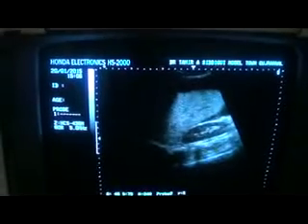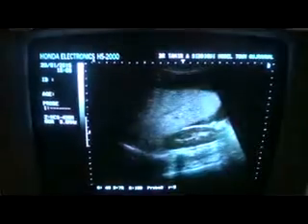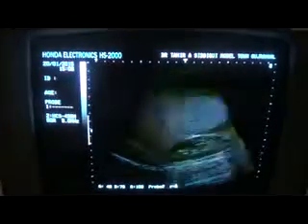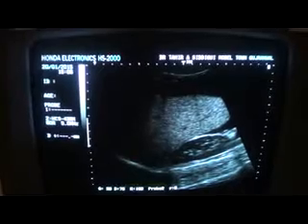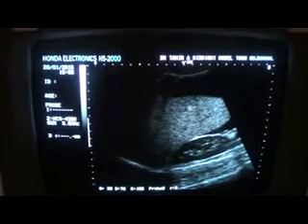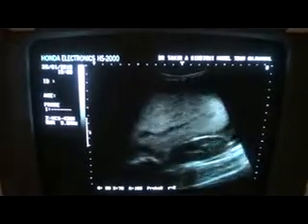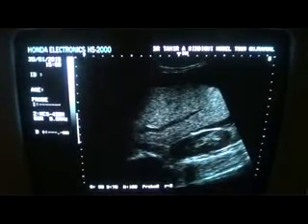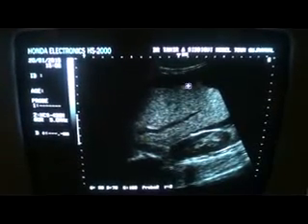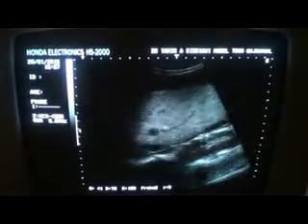This is an ultrasound study of a 35-year-old female with a history of ascites and protuberant abdomen, who is HCV positive. What is seen is that the kidney is normal, both folds are clear, otherwise unremarkable. The liver shows fatty liver parenchymal changes, and the intrahepatic vessel margins are not blurred enough to label it as a cirrhotic liver. However, I will label it as a fatty liver.